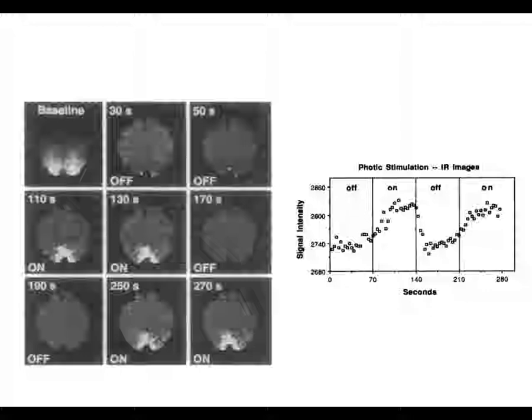And we know where the motor cortex is roughly, and we know that it's crossed. So if you're tapping your right hand, we should see left motor cortex activation. Tapping your left hand, you should see right motor cortex activation. And that's indeed the systematic pattern that they saw. So all of the experiments were very simple and just designed to prove stuff that we already knew existed in the brain.